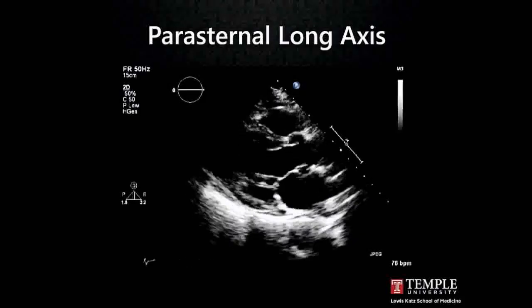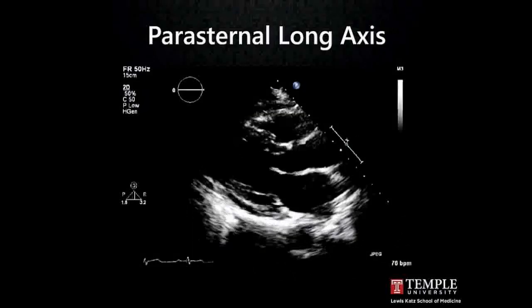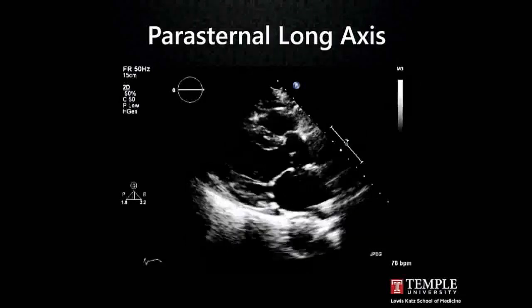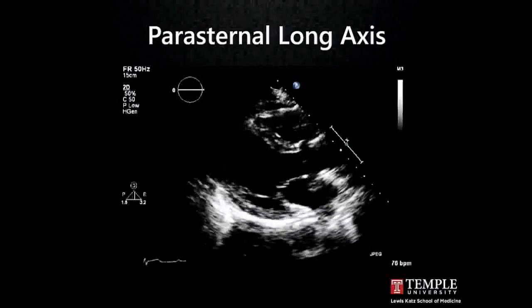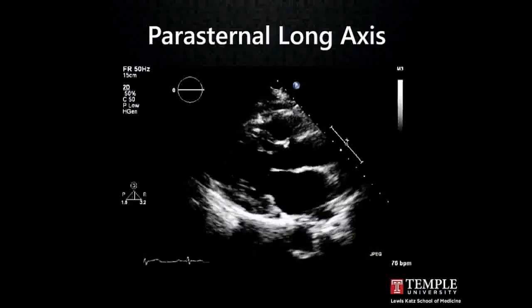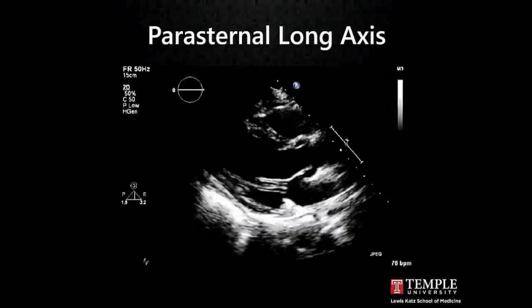So in this case, on axis parasternal long axis, you can see the long axis of the ventricle is nearly 45 degrees to horizontal. The aortic valve is nearly on top of the mitral valve, and the RVOT is displayed at the top of the image. On this on-axis image, you can even see the coronary sinus at the base. You notice that the depth is adjusted such that you see the artifact as it streams off the pericardium beyond the heart. But usually we typically acquire a different image initially, because depth matters.